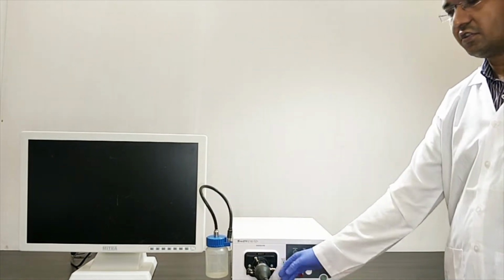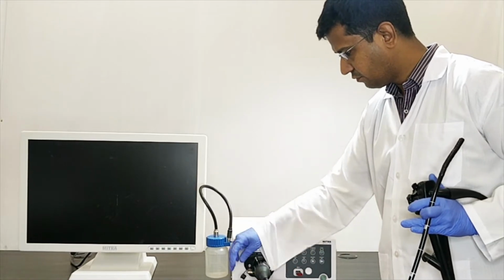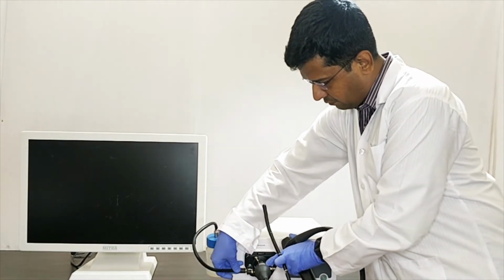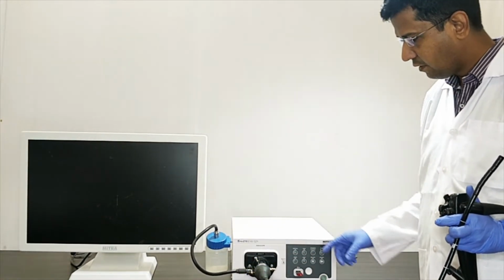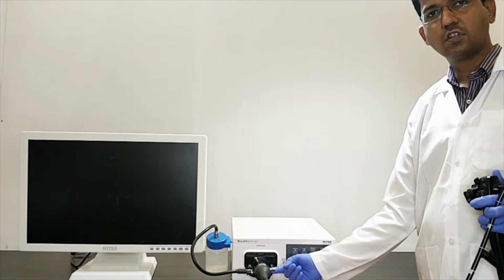So this is the connection. This is a single step connection. You can attach the water container here. There is a leak test port, and you can connect the suction tube here to the suction port.